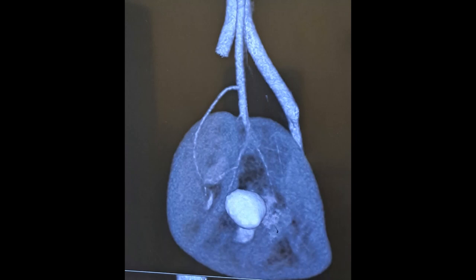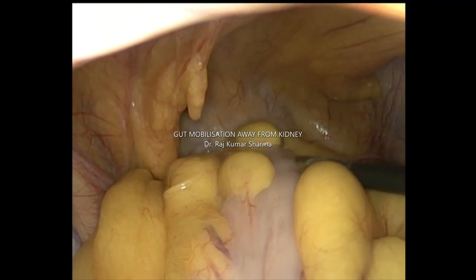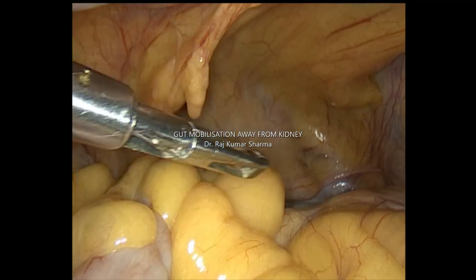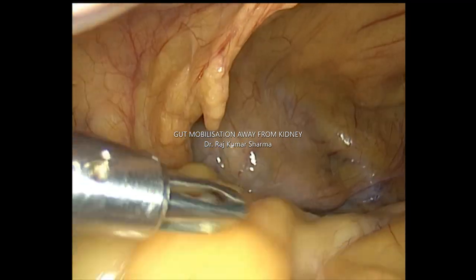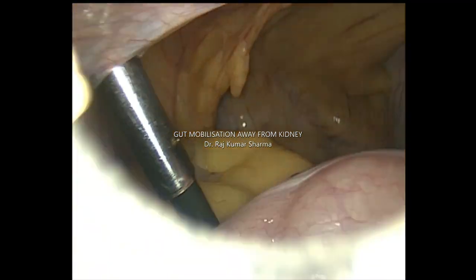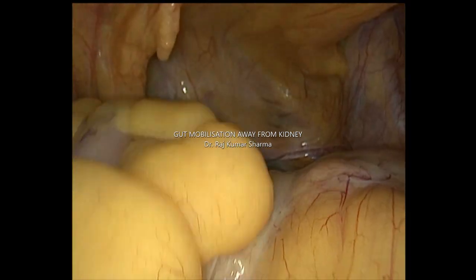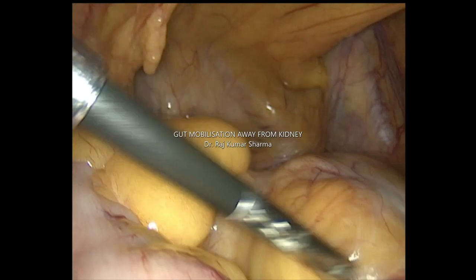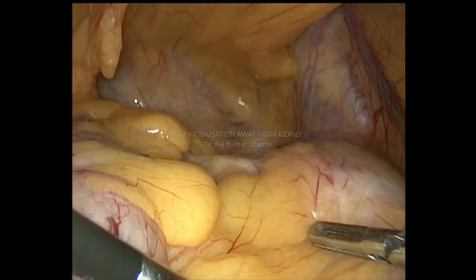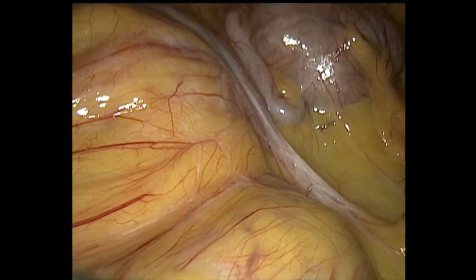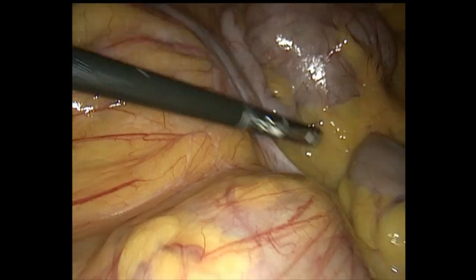Laparoscopy is being done. The first aim is to remove the gut overlying the kidney. We are removing the large gut as well as the small gut from the bulge of the kidney, which is placed ectopically.